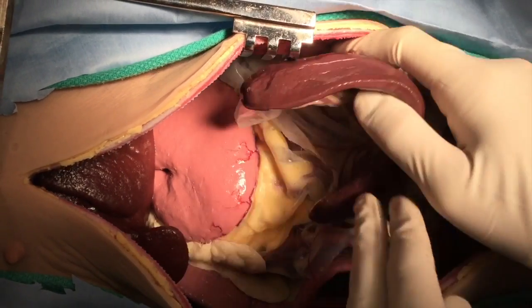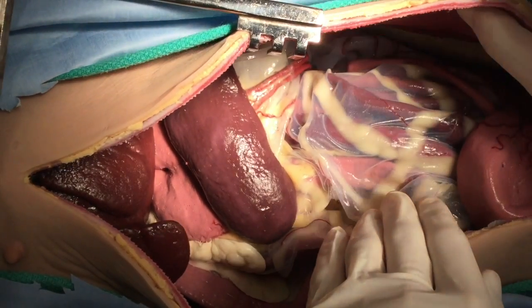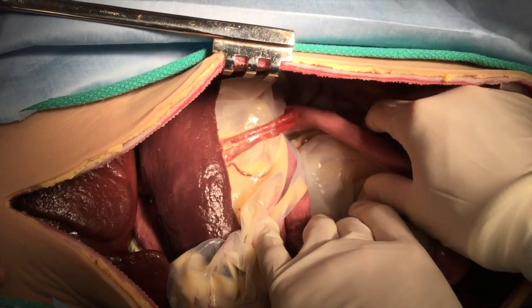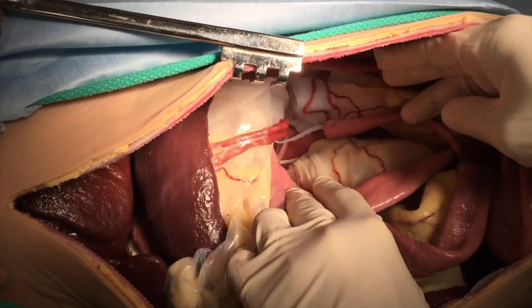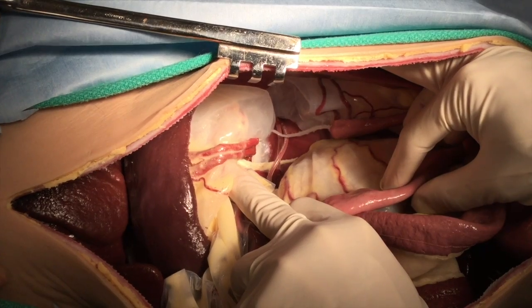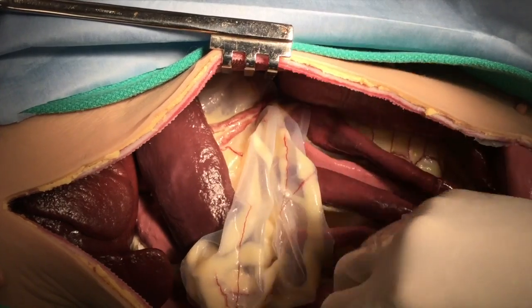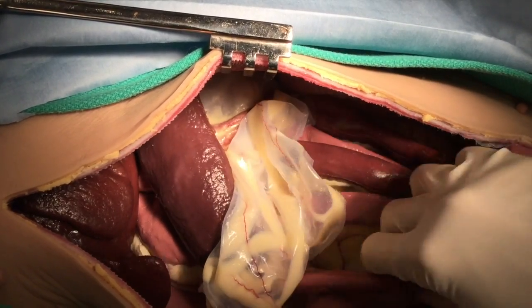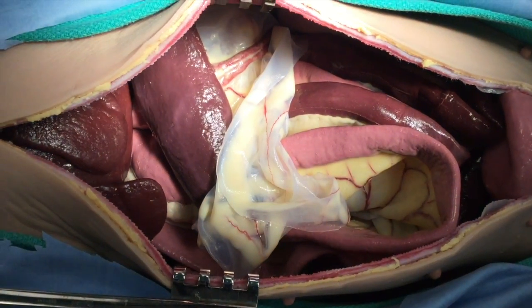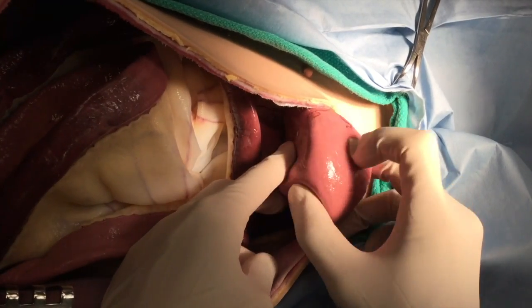Here we have the spleen on the left side and its associated mesentery. Then we'll pick up the colon and use the mesocolon as a sling, pulling it towards midline and exposing the left paravertebral gutter, where there is the ovary, the uterus, the kidney, and the ureter. You can then trace the bowel all the way from the duodenum to the colon.